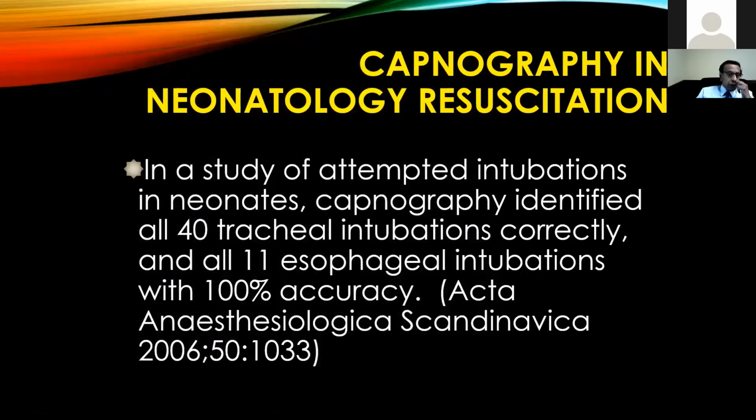What about capnography in neonatal resuscitation? In a study of attempted intubations in neonates, capnography identified all 40 tracheal intubations correctly and all 11 esophageal intubations, with 100% accuracy. And it is very critical that we intubate the newborns correctly in order to have a good resuscitation outcome.